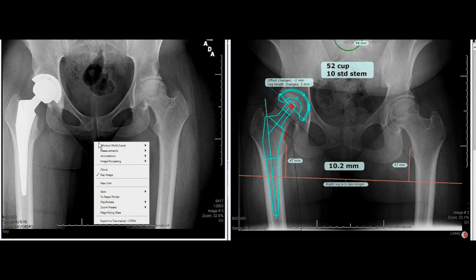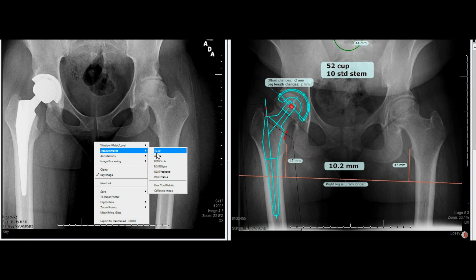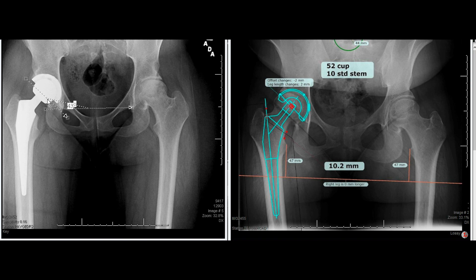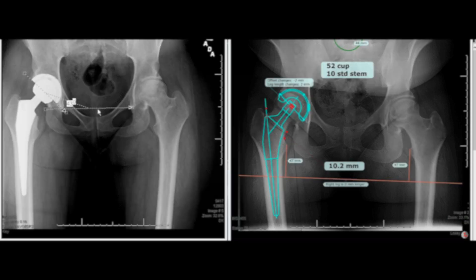I am now going to utilize our angle tool in the PACS system and look at our abduction angle of the cup. A line will be drawn flat to the teardrops, and then to check the abduction angle, you want to draw a line from the most medial point up to the most lateral superior point on the cup that's visible. This gives you your abduction angle of 43 degrees. Thank you for your time, and I hope this video was helpful as you move forward with templating total hip replacement.